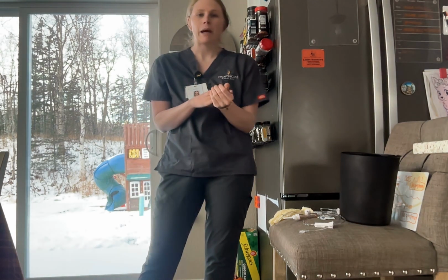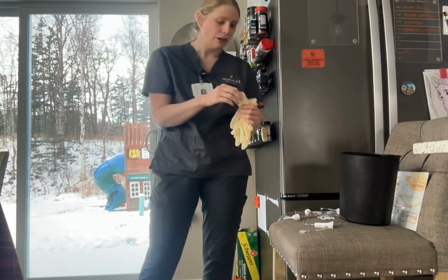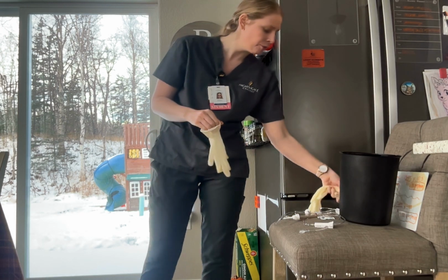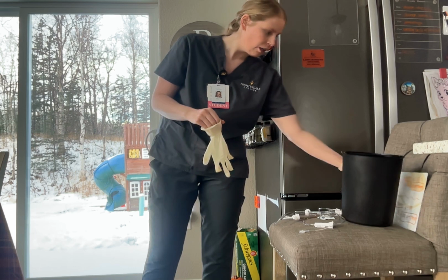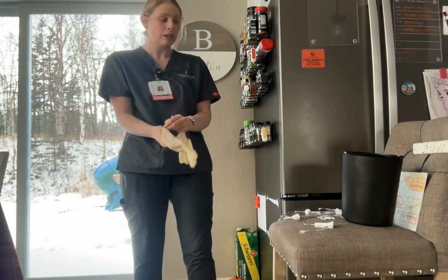So we're going to go ahead by washing our hands, putting clean gloves on, verifying the patient's name and date of birth. Sir, could you please confirm if you have any allergies or not? No? Okay.